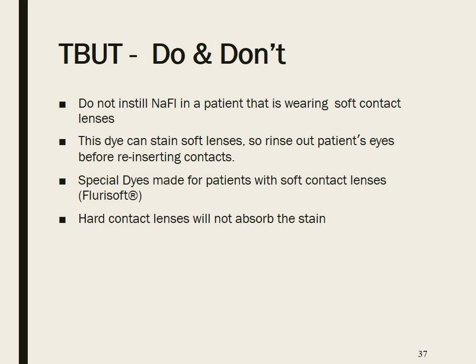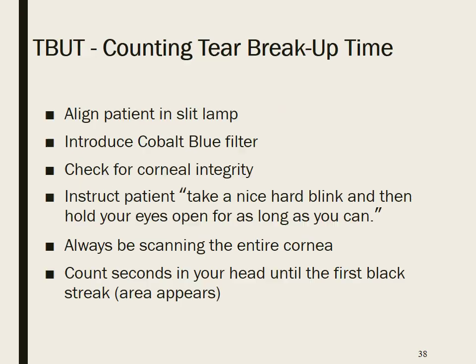Do not instill fluorescein in a patient who is wearing soft contact lenses. This is because soft contact lenses can absorb the stain, and the dye can stain the soft contact lens, so rinse out the patient's eye before reinserting the contact lens. There are special dyes made for patients with soft contact lenses, which we call Fluoresoft. We can use fluorescein with hard contact lenses because hard contact lenses will not absorb the stain.